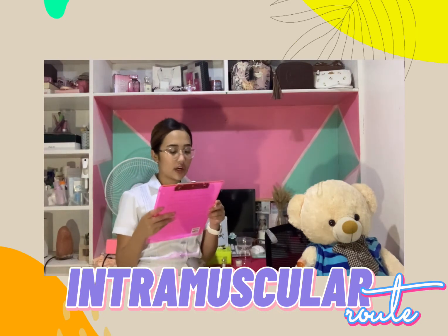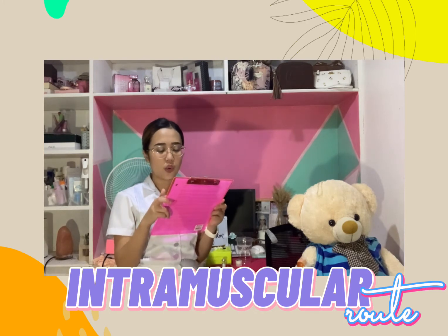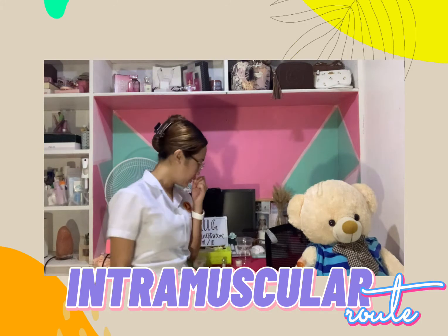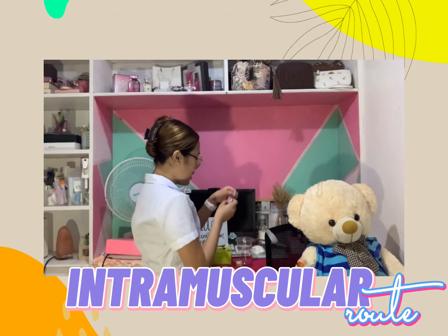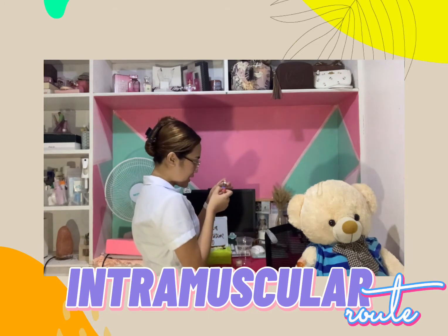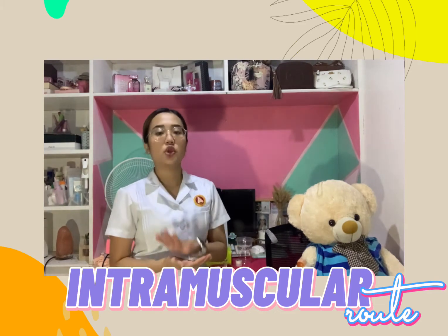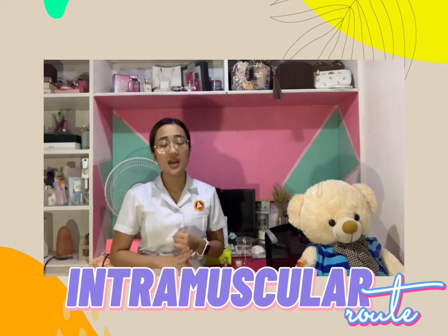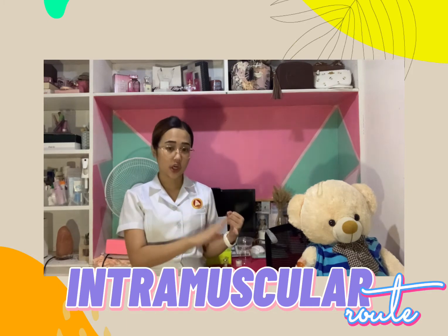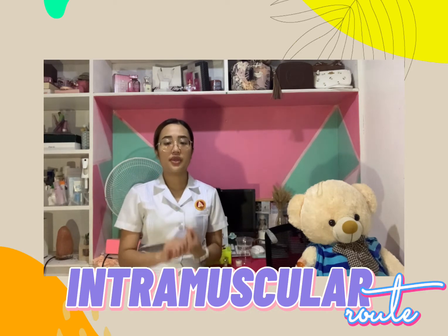As per order, the patient will be having influenza vaccine, IM, at 7 a.m., 0.5 ml. After that, we will read the label of the medication: Vaxigrip, influenza vaccine, vacuna antigripal, expiration date January 1, 2022. We need to make sure to read the label of the medication when taken to the medication tray or medication cart. Also, we will read the label before and after withdrawing the medicine.